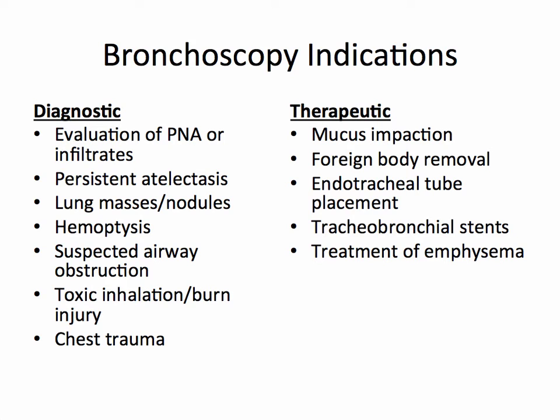Diagnostic indications include the evaluation of pneumonia or infiltrates, persistent atelectasis, lung masses or nodules, hemoptysis, suspected airway obstruction, toxic inhalation or burn injuries, and chest trauma. Therapeutic indications include mucus impactions, foreign body removal, endotracheal tube placement, tracheobronchial stent placement, and treatment of emphysema.